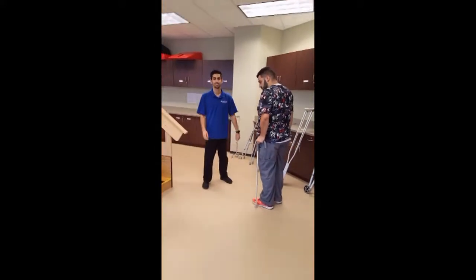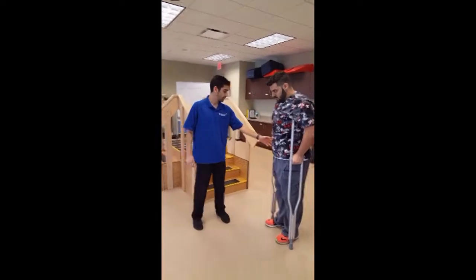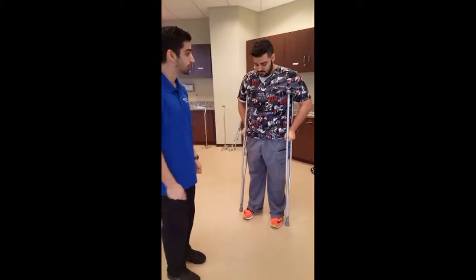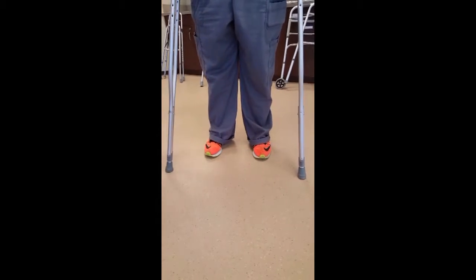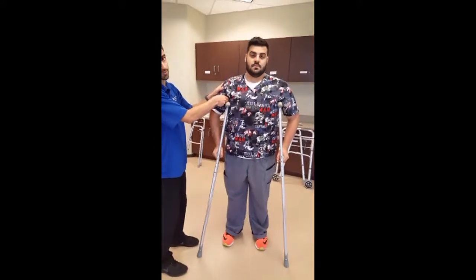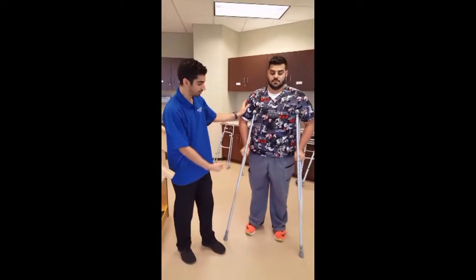So for the axillary crutches, what you want to make sure is that he stands straight, put the tips of the crutches 4 to 6 inches forward, and then 2 inches outwards. And then from here, I can measure to see. Put your hands off to your side. It's at his ulnar styloid, it's at his greater trochanter, and then he has about 2 inches from his axilla to the crutch. And that's how you measure for the crutches.